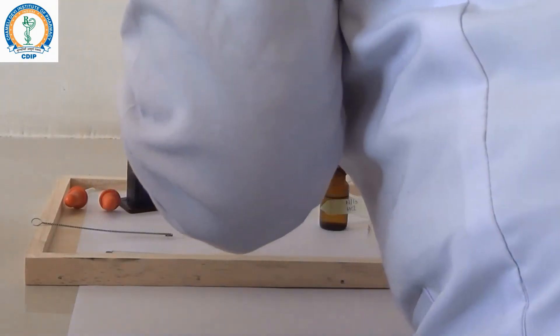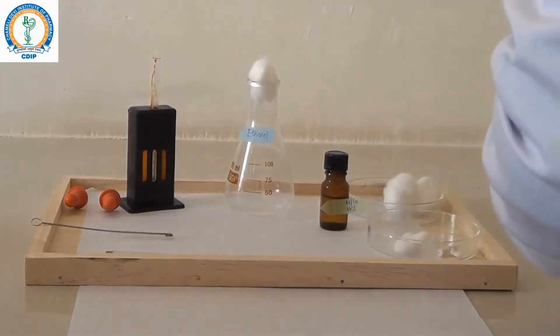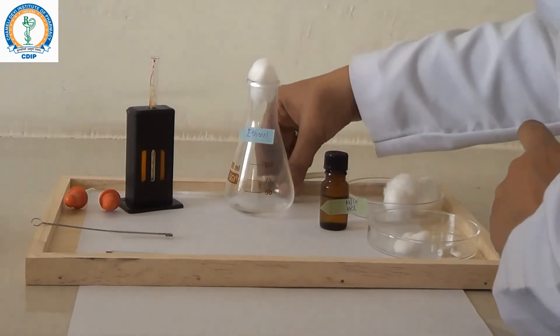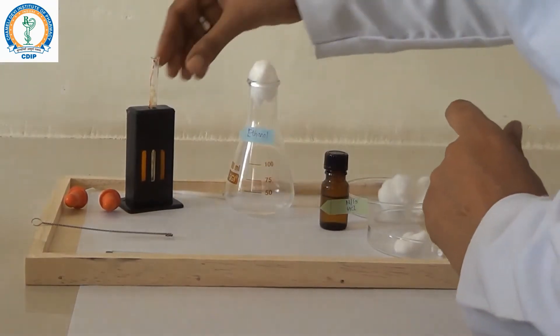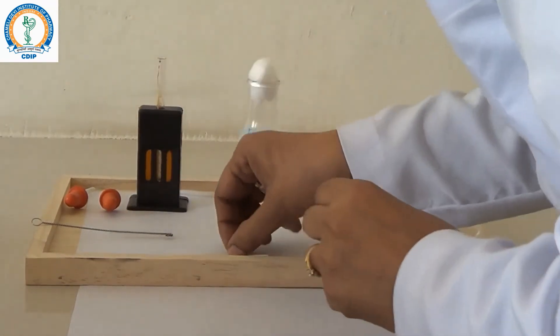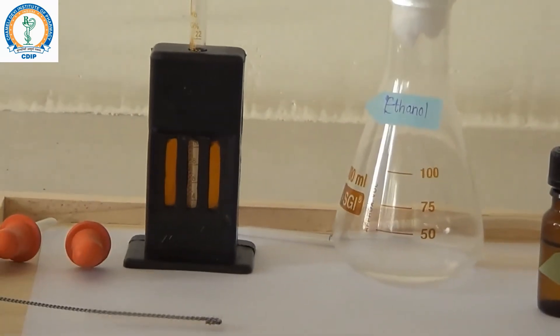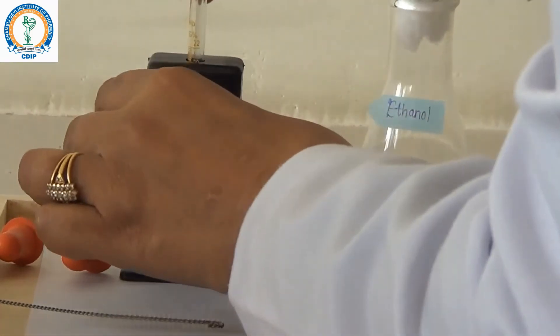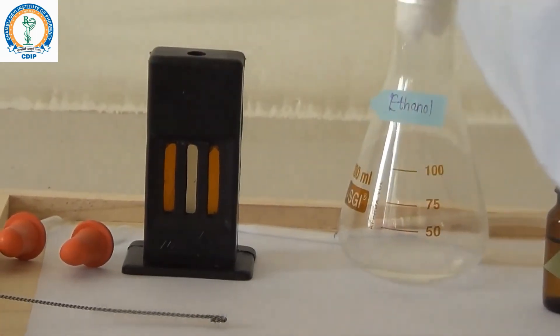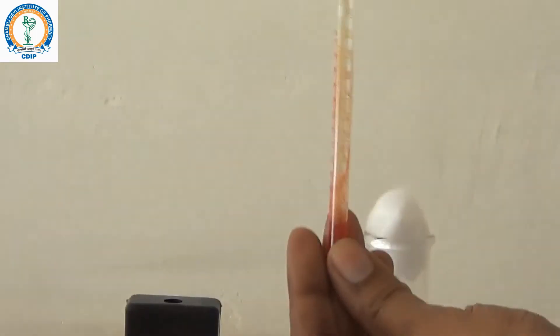Now, immediately pour this blood into the graduated tube which already contains N by 10 HCL, and mix the blood and the HCL thoroughly.